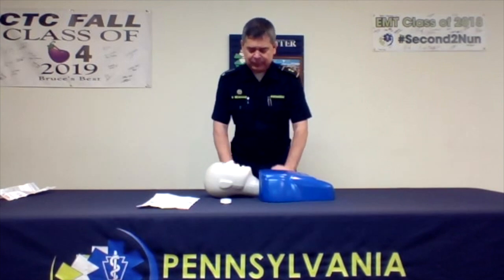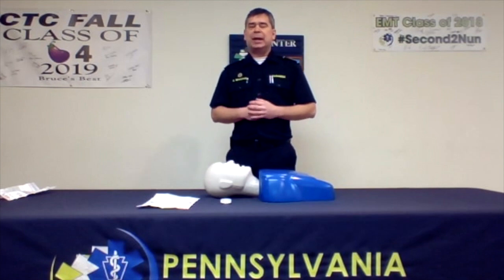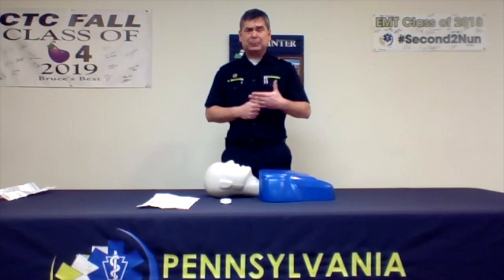What you can expect from doses of Narcan is the patient may wake up in 2 to 3 minutes after the first dose. If not, a repeated dose can be given. But things to understand: when you administer Narcan to an opiate or opioid overdose patient, that patient may become combative. That patient may also become nauseous and may vomit. Other considerations to remember are if there are any other drugs in the system.